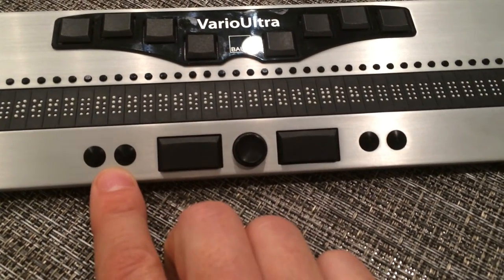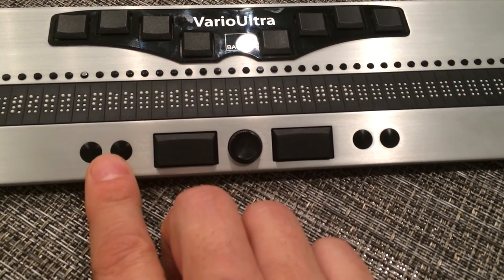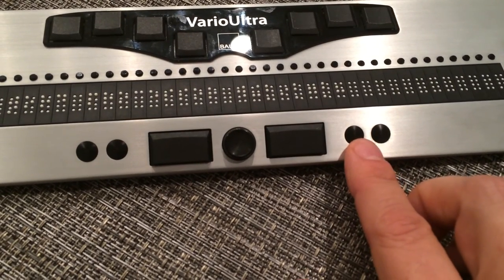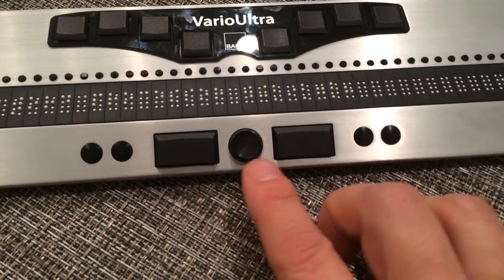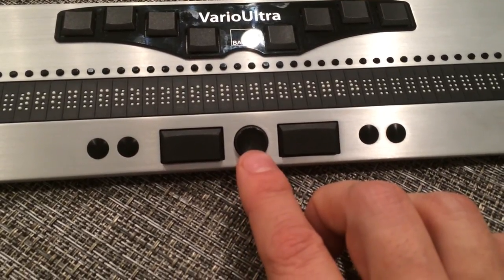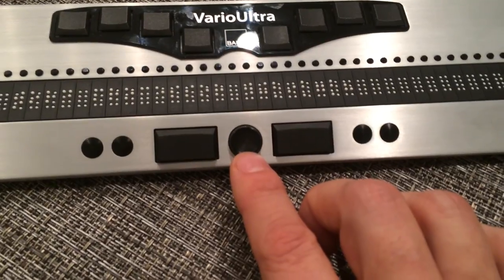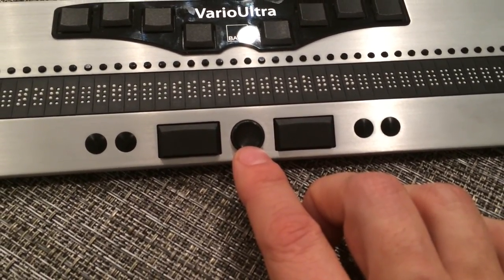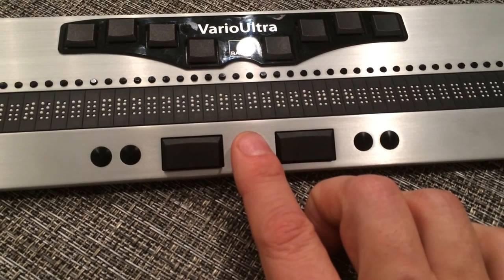On the left-hand side of the left thumb key, we have two system buttons, S1 and S2. And to the right of the right thumb key, we have system keys S3 and S4. And then finally, in the middle, we have the Navi stick, the same as we have on the 20-cell version. This is a five-way button, which means it goes up, down, left, and right through vertical and horizontal lists. You can also press down on the device and use it as an enter key.